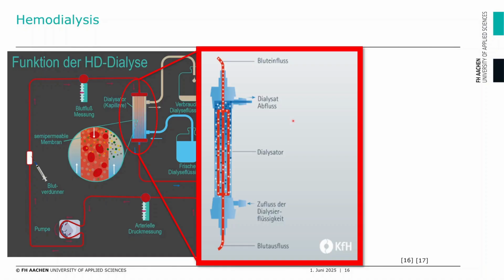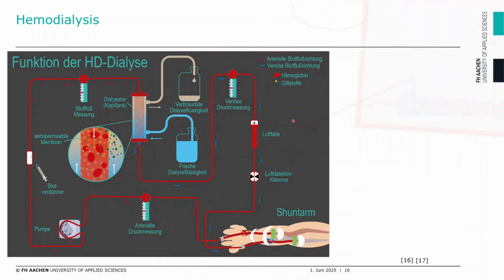Dialysis fluid is fresh solution that is added to the dialyzer and has not yet undergone molecular exchange. Dialysate is the solution that comes out of the dialyzer and has undergone molecular exchange. It now contains urinary substances. The materials used for hollow fiber membranes are often synthetic polymer membranes such as polysulfone, polyethersulfone, polyacrylonitrile, and polyamide blends.